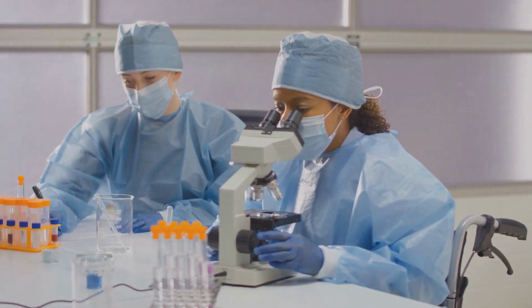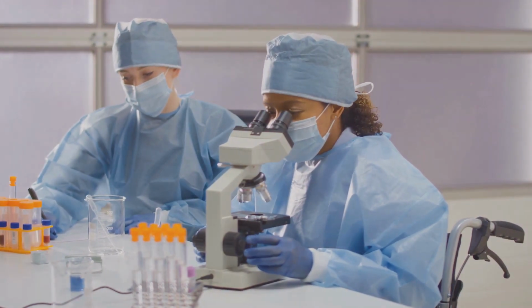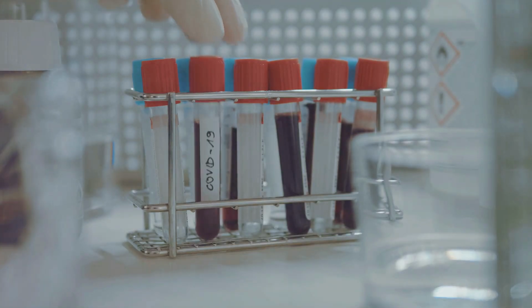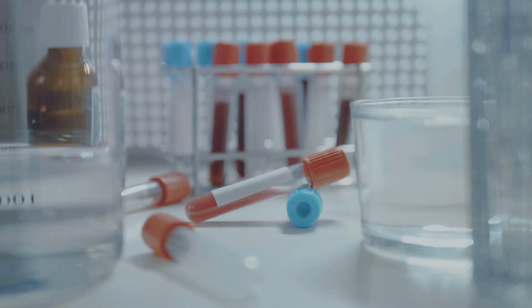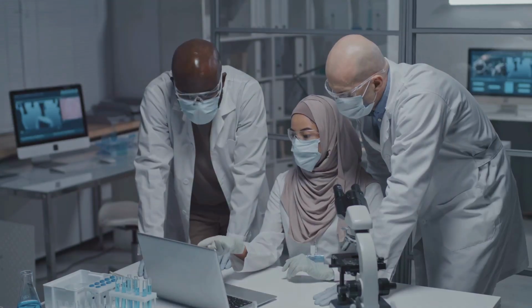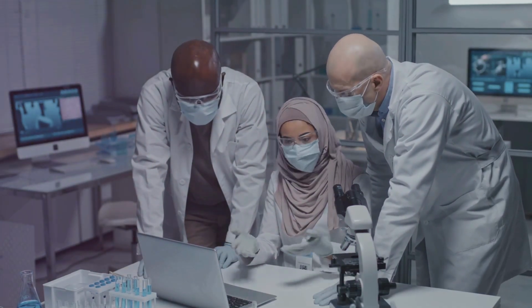ISO 20658 is an international standard that outlines best practices for handling samples in medical laboratories. It provides a comprehensive framework to ensure that samples are collected, transported, received, and handled in a way that minimizes errors and maintains their integrity. This standard is essential for any laboratory involved in the analysis of human samples.